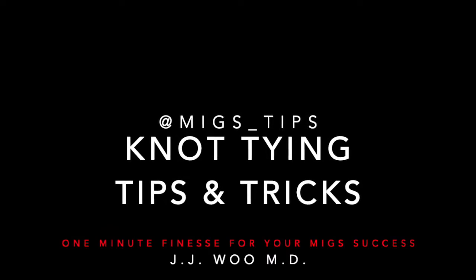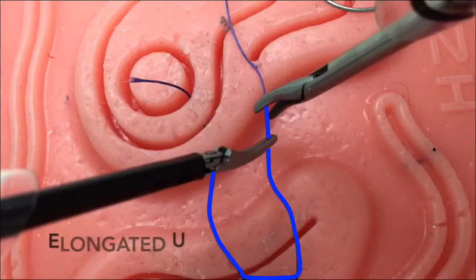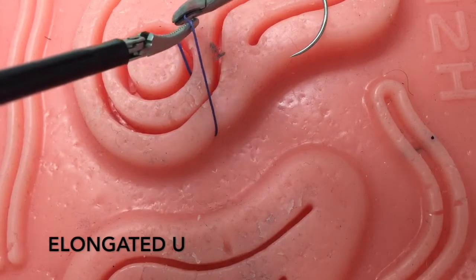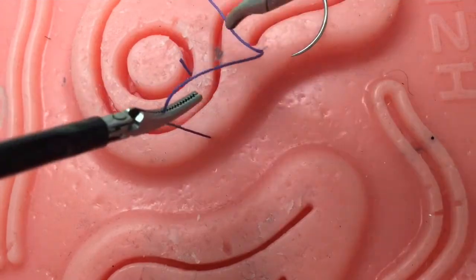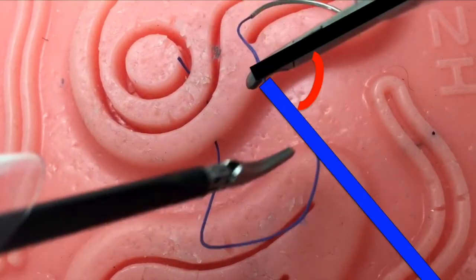Knot tying tips and tricks. By creating an elongated U instead of a shortened U, you will not struggle with not having enough suture to wrap on your instrument, and you will be able to avoid a large instrument-to-suture angle. As shown by creating an elongated U, we have effectively minimized our instrument-to-suture angle.